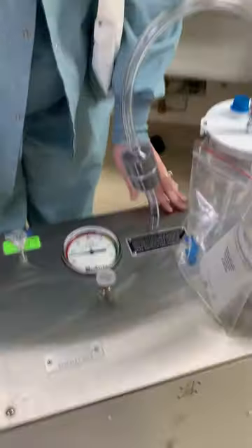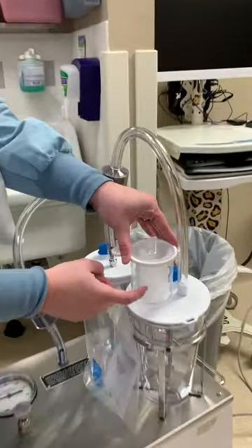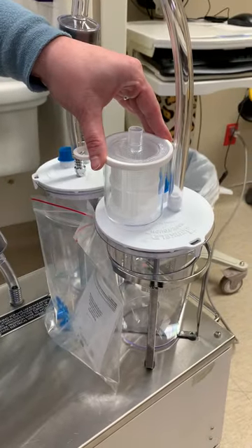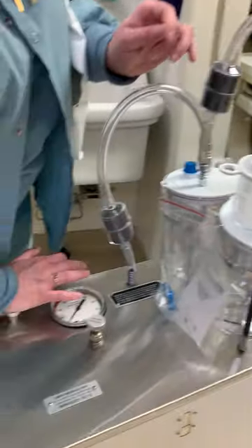And then they will start suctioning. Your contents will get caught in this trap here. At the end of the case, you will just push this down to turn it off.